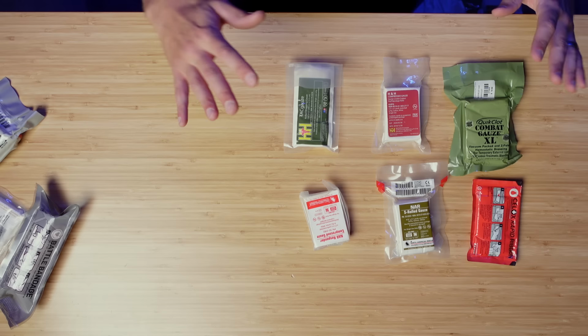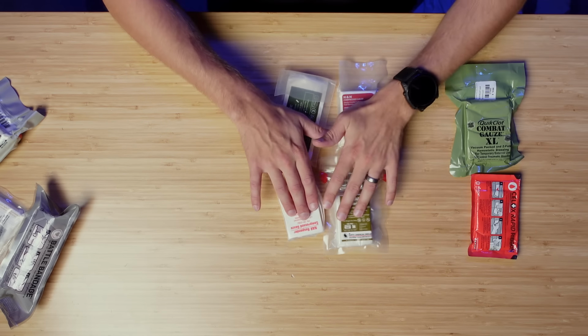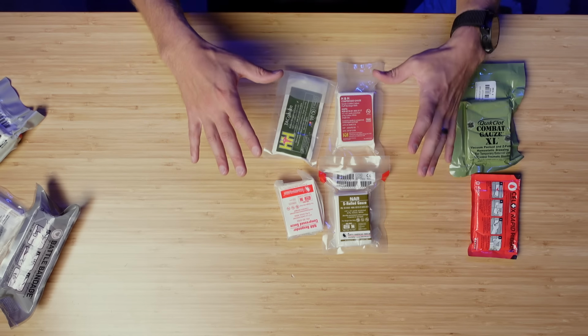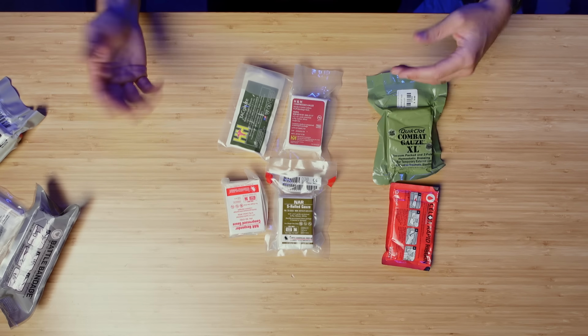the event of a massive arterial bleed. Now, these are a little bit different. Over here, we have hemostatic gauze, and then this gauze over here is non-treated. Survivability between these two is pretty similar. This is gold standard, but this is good enough. There's just a huge price difference. This is going to be 50. These are going to be in the ones to tens of dollars.